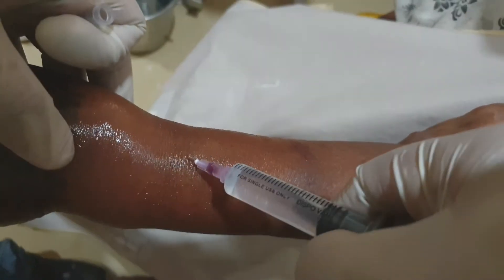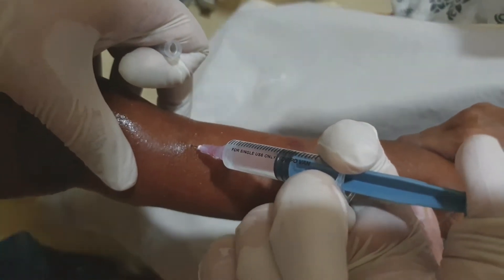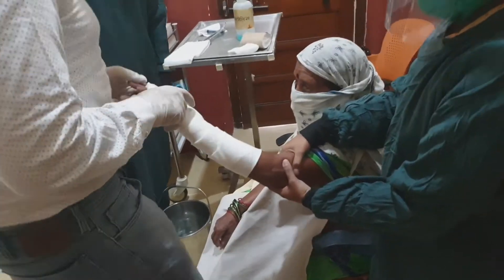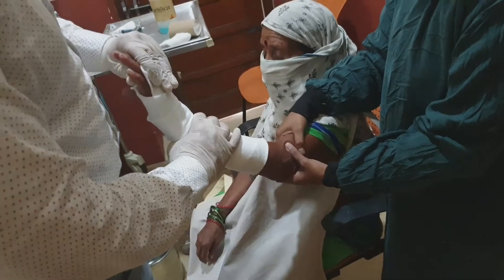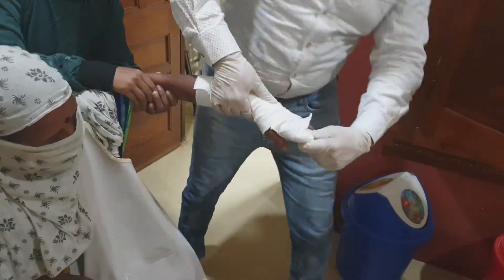Blood will appear in the needle hub. With experience, you will be able to differentiate between arterial blood and hematoma blood. After injecting it, you have to apply the soft roll and perform a cogwheel motion to disimpact the fracture.